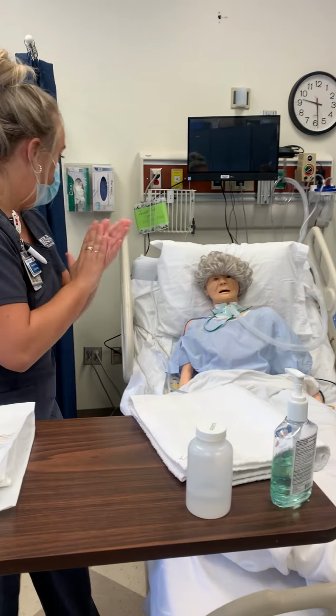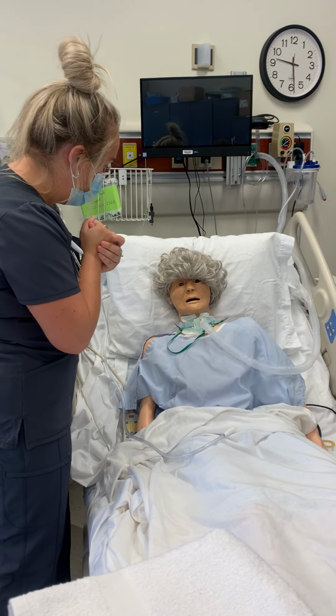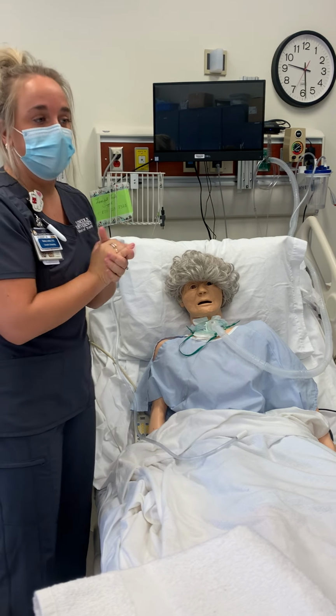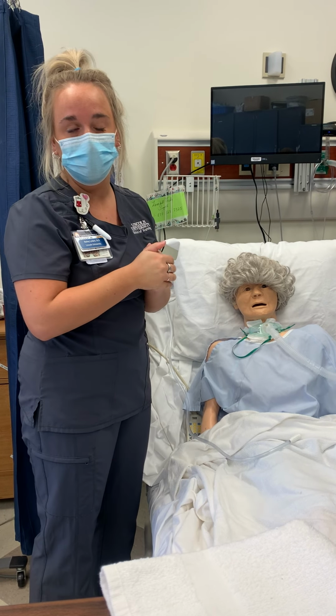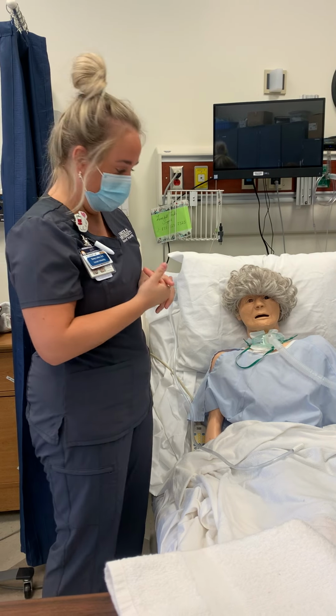Hi, Mrs. Smith. My name is Bailey, and I'll be your nurse today. We're going to be suctioning your trach, and then we're going to be cleaning it and changing it, okay? And if my patient wasn't able to talk and she had family in the room or something, I would have them verify her name and date of birth. And then I'd want to go ahead and establish an effective form of communication with her.